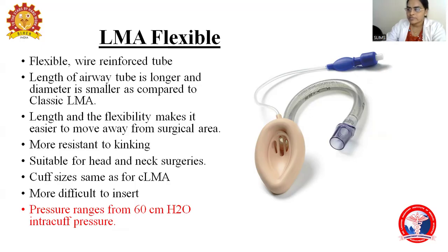Cuff sizes are the same as the classic LMA and it is more difficult to insert since it doesn't have stiffness in the body. The pressure ranges from 40 to 60 centimeters of water.